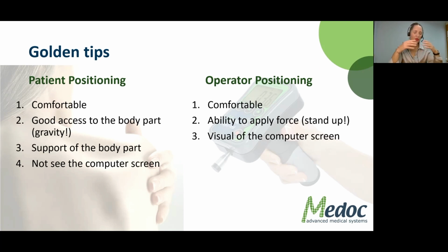I want the patient to be concentrated only on the stimulus that you're applying, and not about anything else. They don't need to see the computer screen. You will need to arrange the room accordingly. So for instance, if we're going to test my shoulder, then you probably want to move the computer like this. So I will not be able to see the computer, but the person behind me testing my shoulder will. Okay, so keep this in mind when you're setting up your room and your testing space.